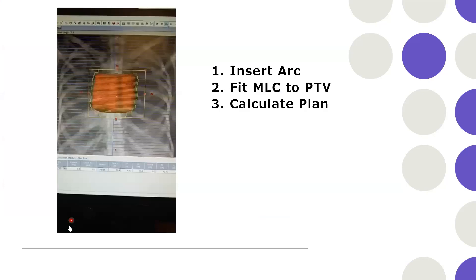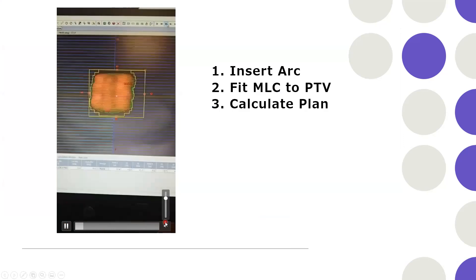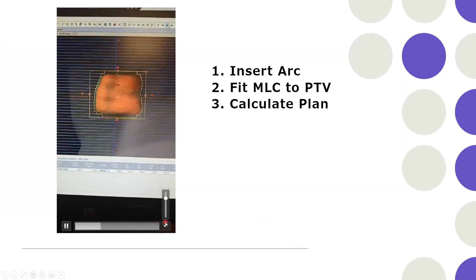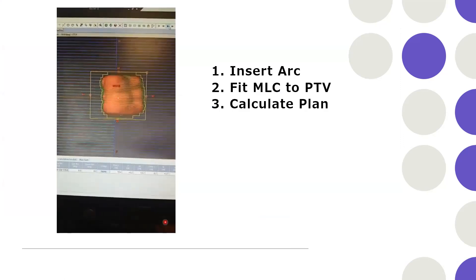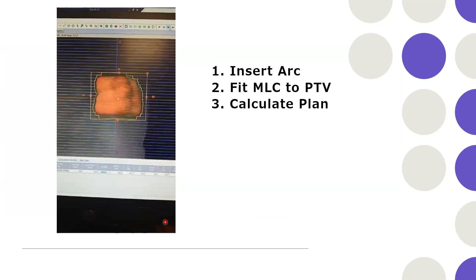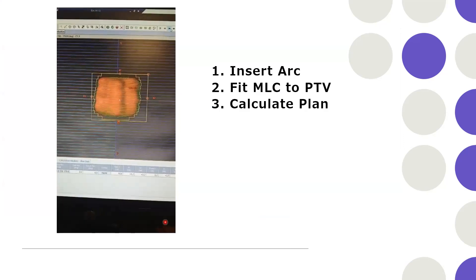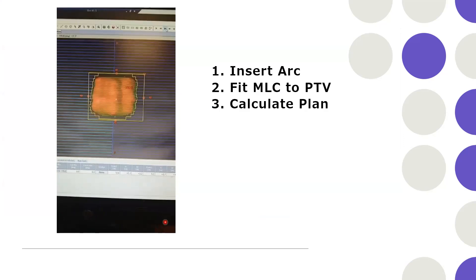Here is a video showing how DCAD works. You can see the volume encompassed and the arc going around — it's quite simple to create the plan. You insert the arc the same way you would for VMAT. Then, without going into optimization, fit the MLC to the PTV and calculate the plan. These are the three simple steps and the plan is ready.